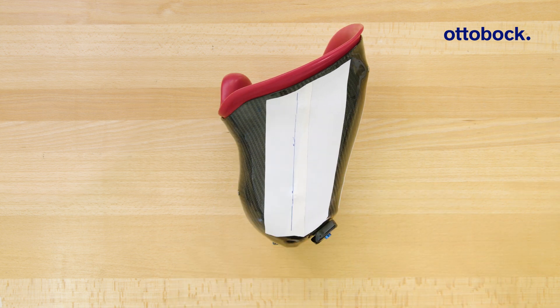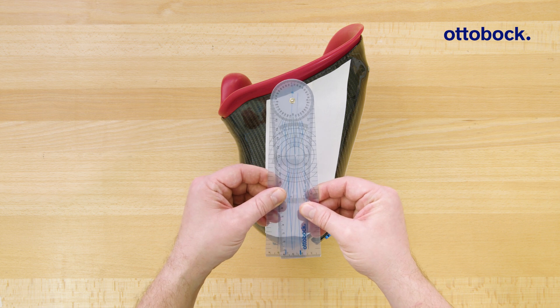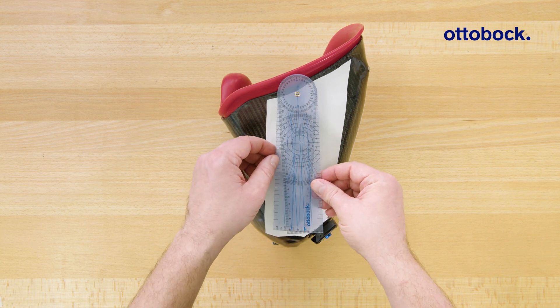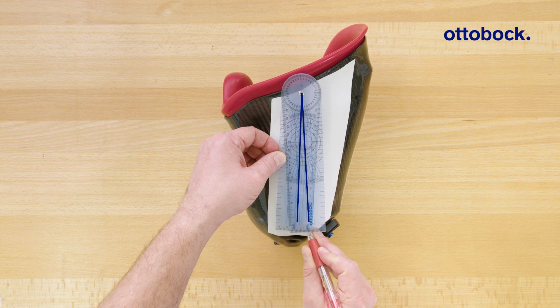The prosthetic socket should be aligned in adduction since that is the case with the physiological leg. An angle of 6 degrees is a good angle for an average residual limb length. The optimum value may differ slightly for the individual user.